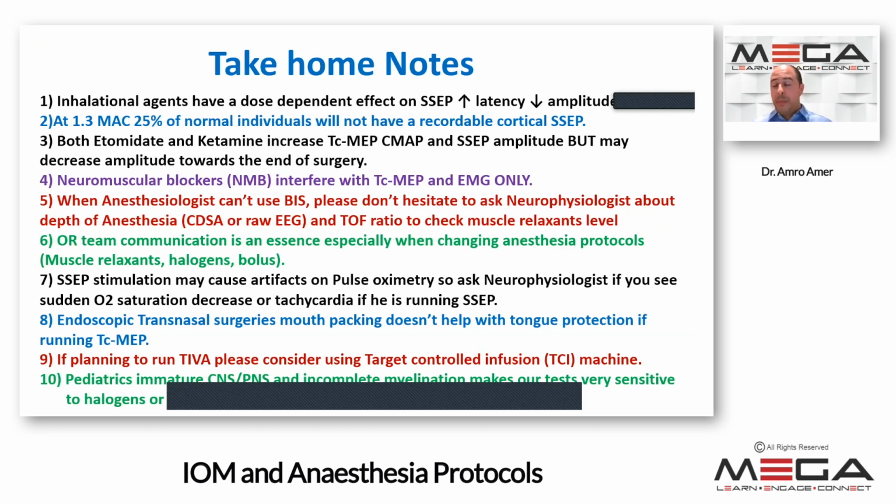Communication is the best thing to do from either side. If you give a pulse, please let me know. If I'm stimulating, usually when we stimulate the hands or something close to the pulse oximeter, you can see an artifact affecting your oxygen saturation or heart rate. If that happens, it's from my stimulation, so I will let you know. That's mainly everything, and thank you so much.